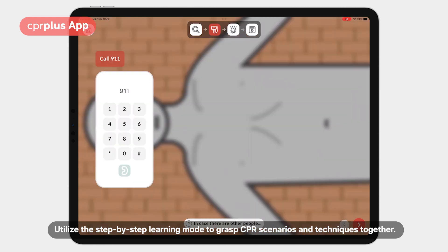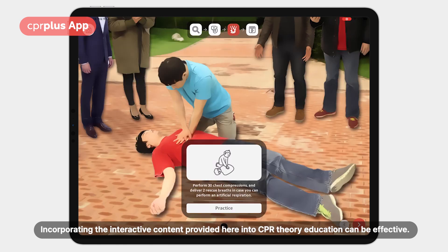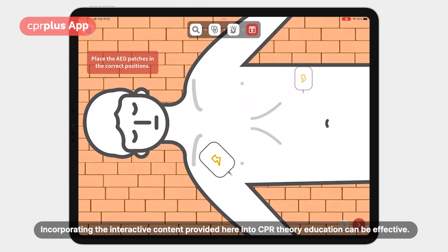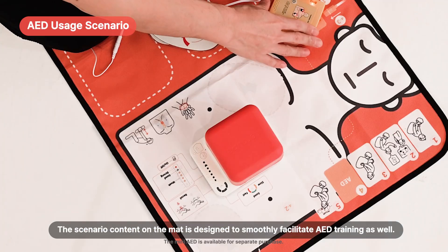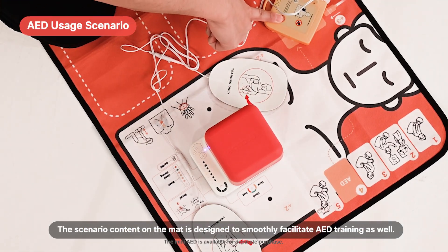Utilize the step-by-step learning mode to grasp CPR scenarios and techniques together. Incorporating the interactive content provided here into CPR theory education can be effective. You can also practice AED protocols using the Scenario Mat and Mini AED.